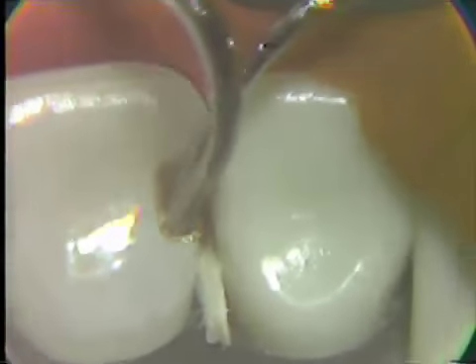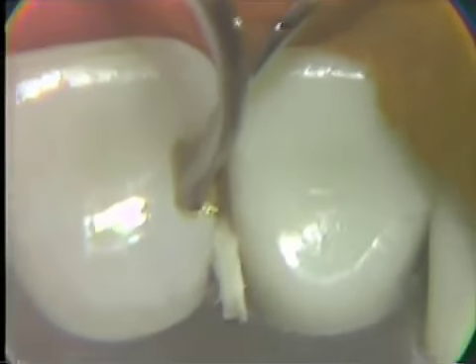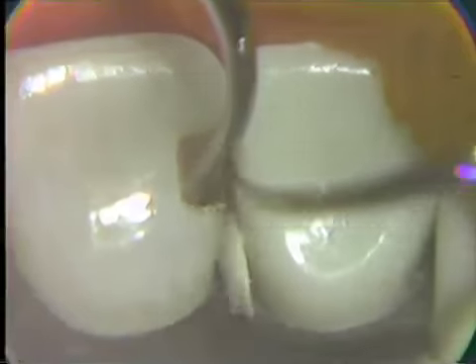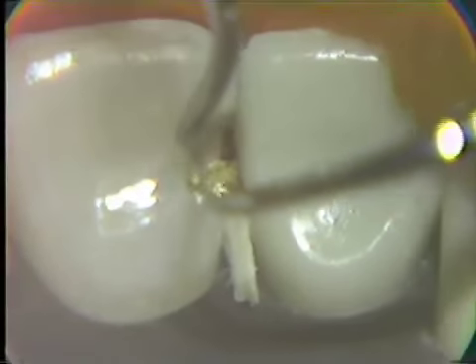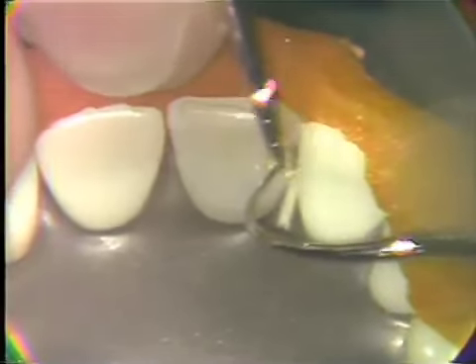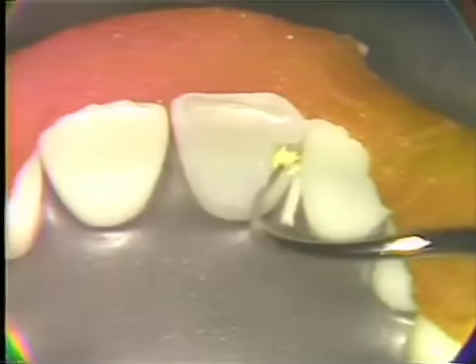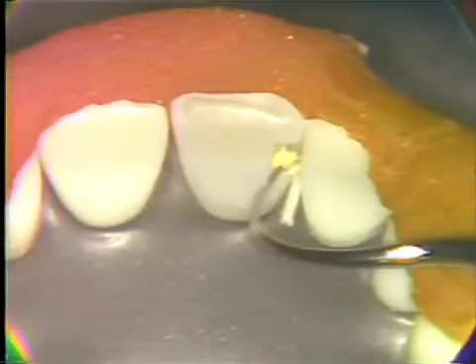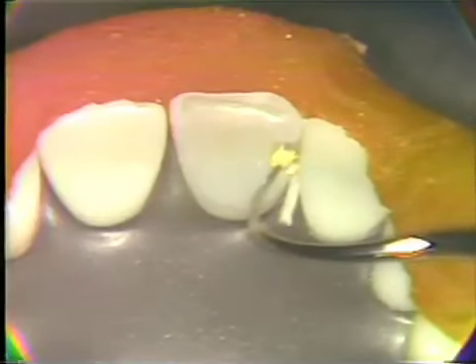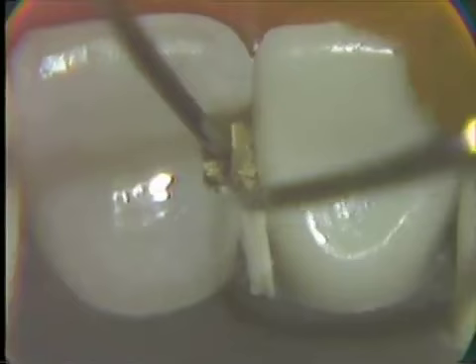With that area condensed well, we'll then transfer the holding instrument to that position and carry out the condensation then along that cervical area and on over to the labial cervical. We're in need then of another piece of foil. Carry through the routine annealing process of this. Lay it into position.